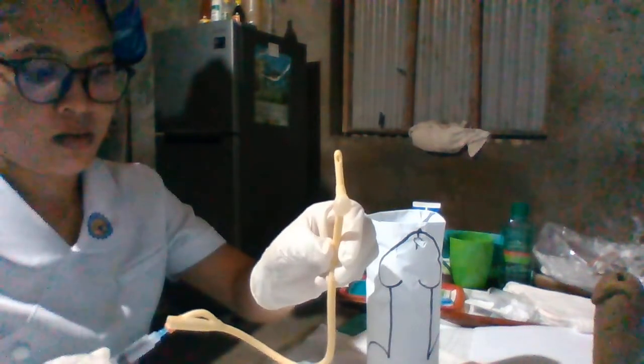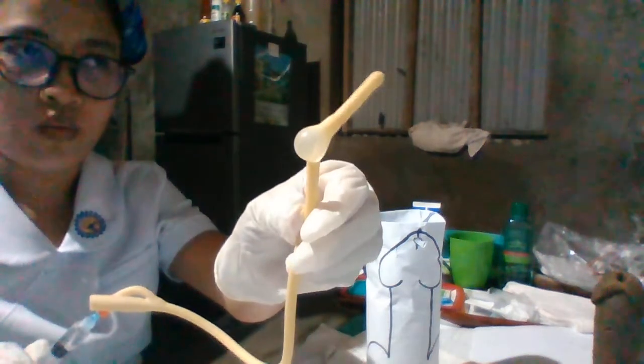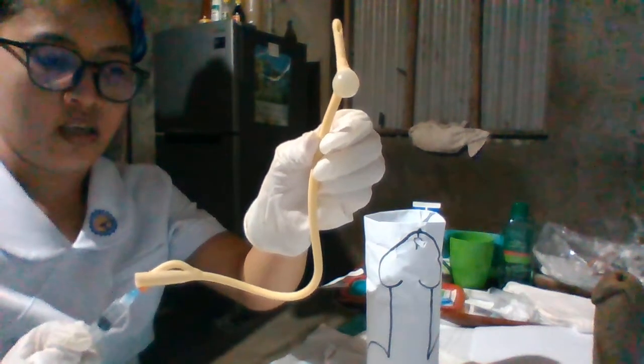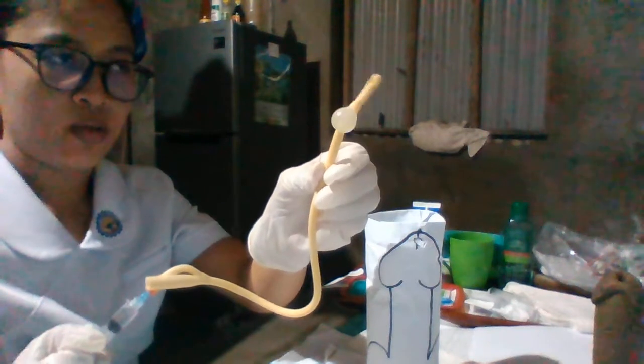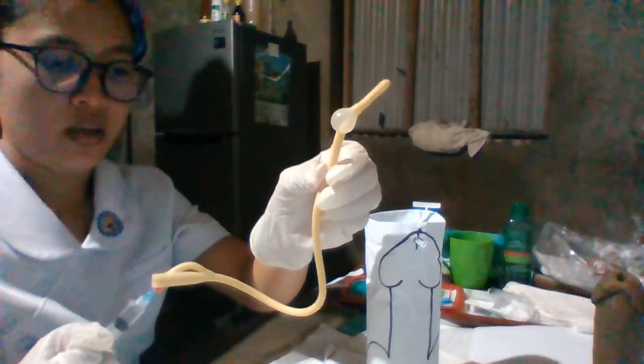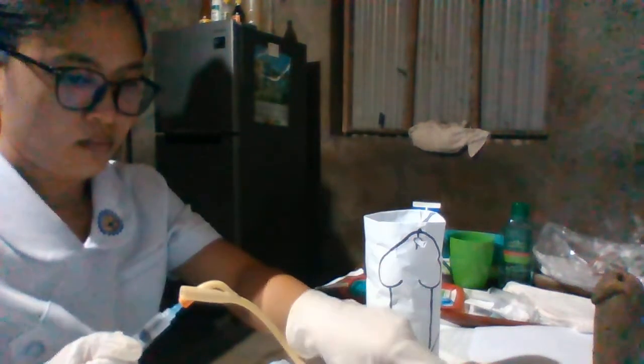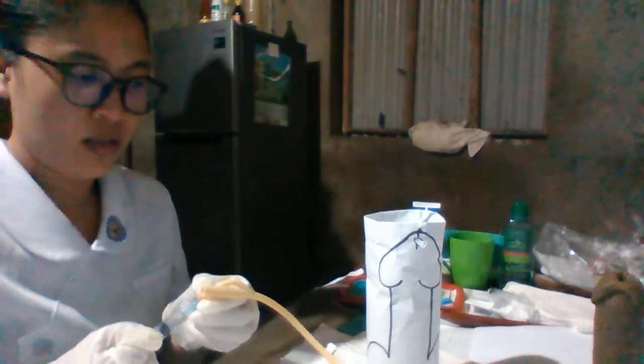We will look at this to see if it inflates when we inject the fluid in. So here, this happens. So it was working. So after injecting it, we have to aspirate the fluid so that we can do the next procedure.